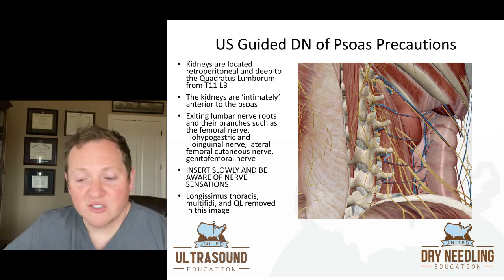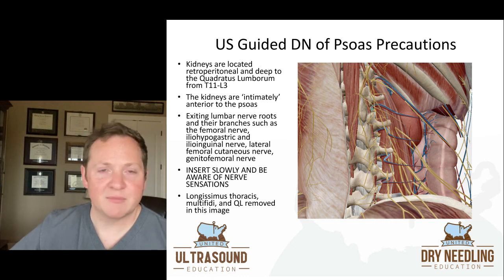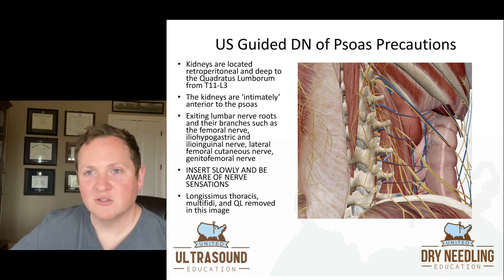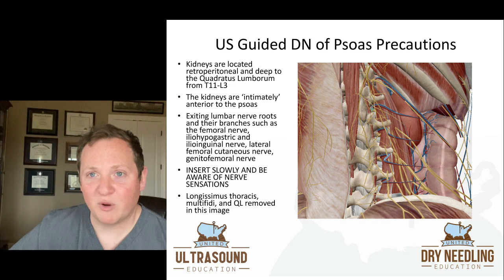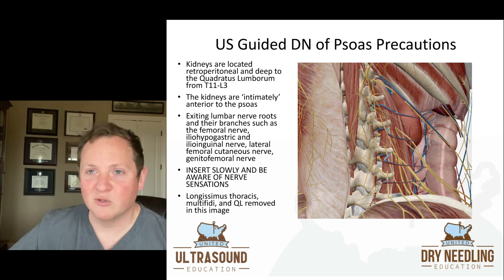Because of all those nerve structures, we insert slowly and we are very aware of any nerve sensation reported by the patient. While inserting the needle into the psoas, I'm constantly talking to the patient: 'How does that feel? Does that feel achy? Crampy? Let me know if you feel any tingling, any lightning bolts, any shooting tingles.' I can see the needle go in on ultrasound and see exactly where it is between segments, but I can't see all those little nerves. So if they start to feel sparkling tingles instead of the achy crampiness, we need to reevaluate and readjust that needle because we're too close to nervous structures.